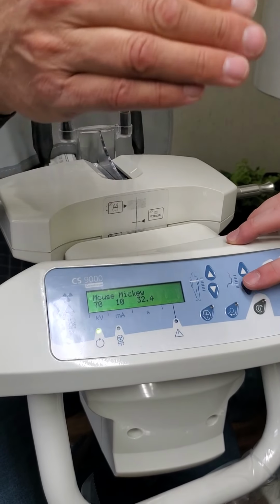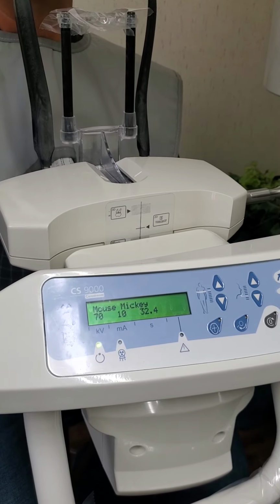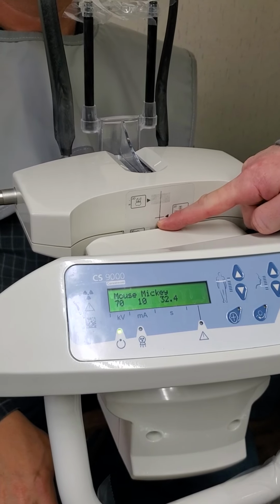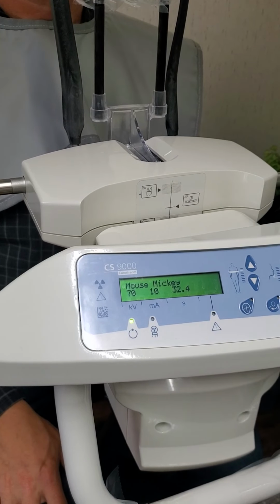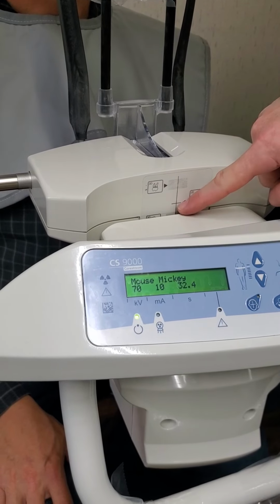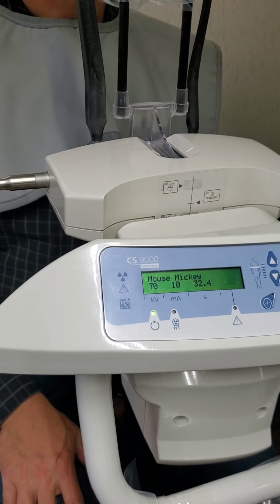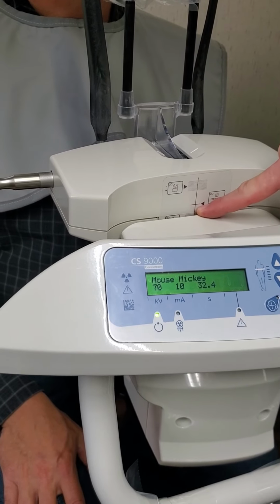Watch, if you take your camera and you start moving it up, you're going to see more lines. It's going to look in a different position, so you have to be level straight on. Okay, so if you're level and it's covering up all of the dots for that lower, that will tell you what you're going to include in your image. Meaning, now you will see everything, every part of that tooth from crown to root tip. So you want those lines all covered up.